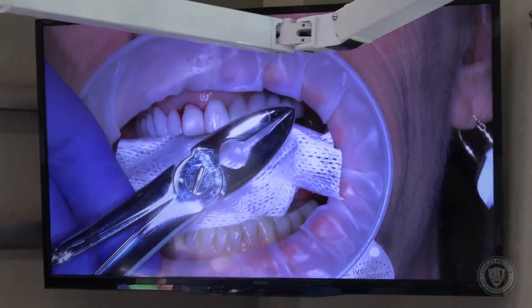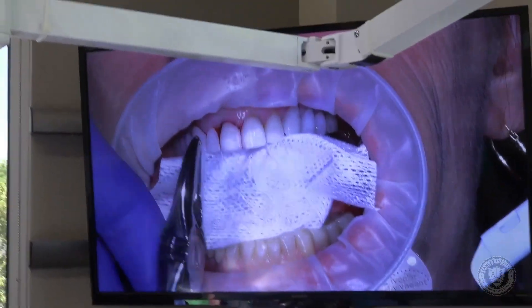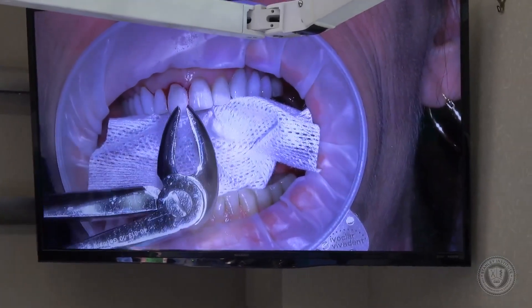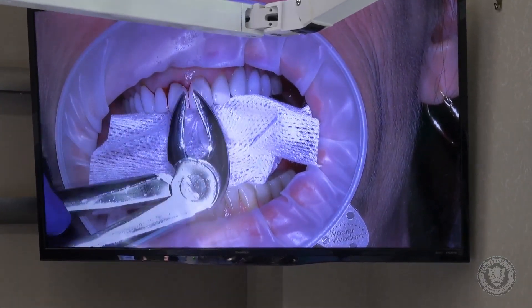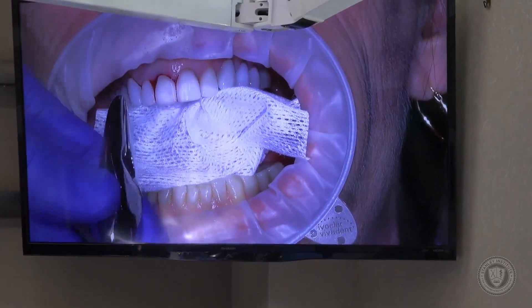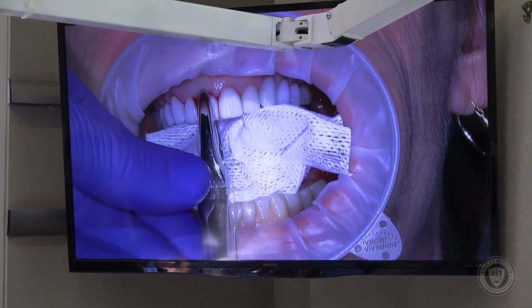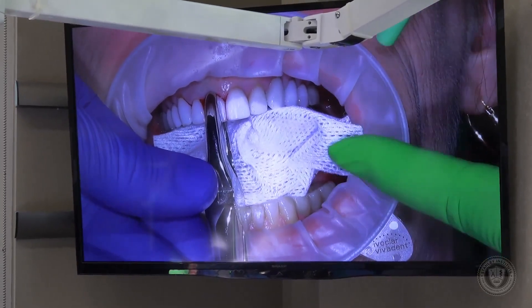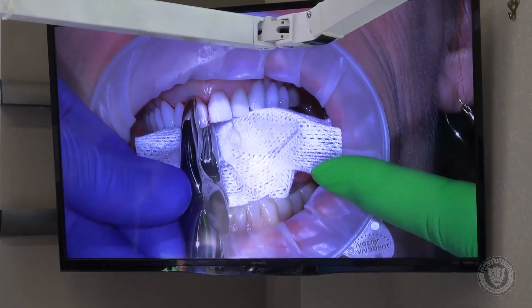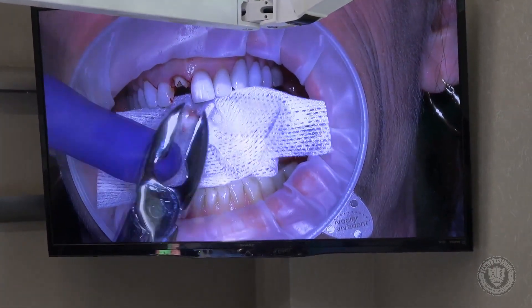These are the straight forceps. I don't use these day-in and day-out — I normally use the ash forceps, which give a great mechanical advantage — but today I'm using these because the ash forcep gets in the view of the camera. This is the crown that has fallen off; it was temporarily bonded back in place. We're going to remove it gently, being very careful not to damage the adjacent crown. That came off just the way we expected it to.